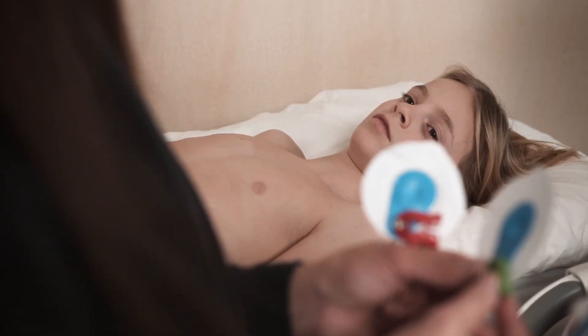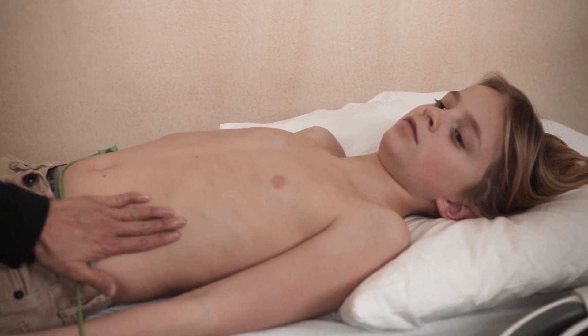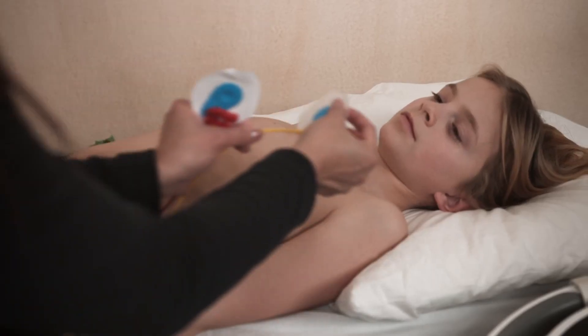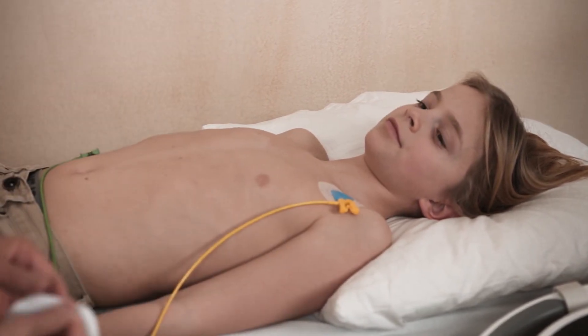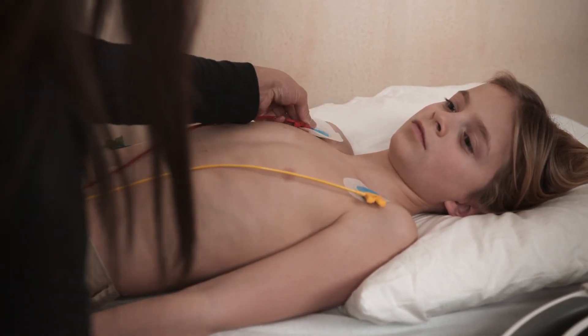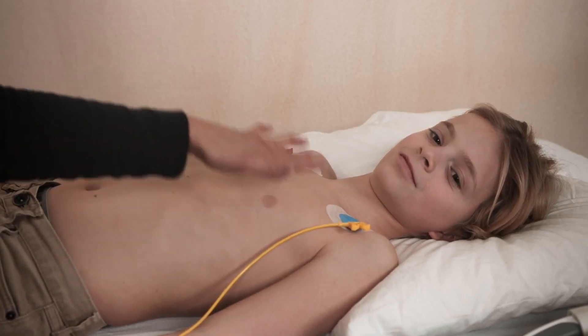It is standard for any echocardiographic study to place three ECG leads on the chest and abdomen such that we can have proper acquisition and triggering of the loop beats during image acquisition. For positioning of the ECG leads, place one lead at the lateral aspect of either side of the abdomen — away from your scanning field which will be in the middle of the abdomen. The second ECG lead is normally at the left shoulder, and the third ECG lead is placed at the right shoulder. This allows an ECG to be captured at the time of recording. It doesn't really matter which colours you use as long as the ECG leads are placed in these positions.